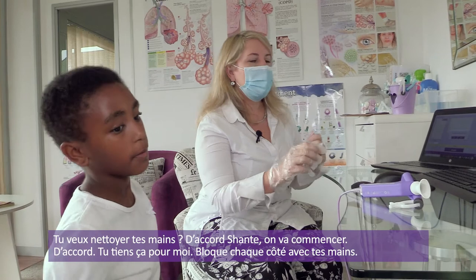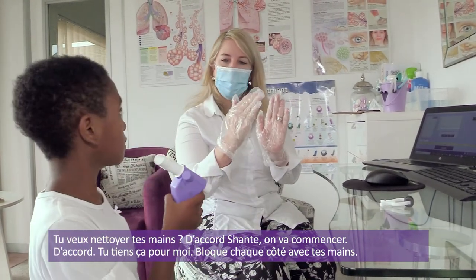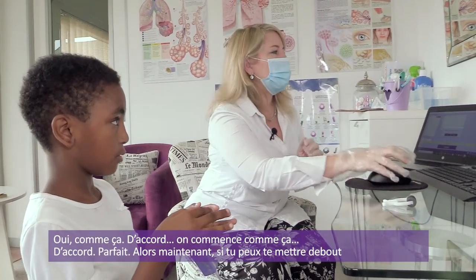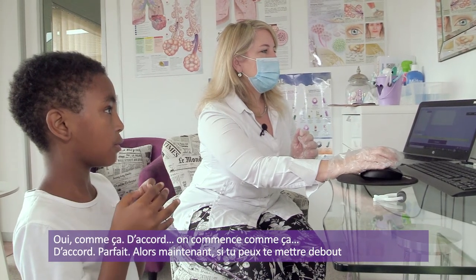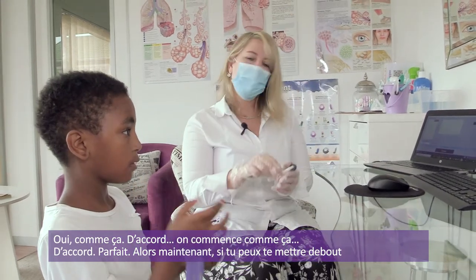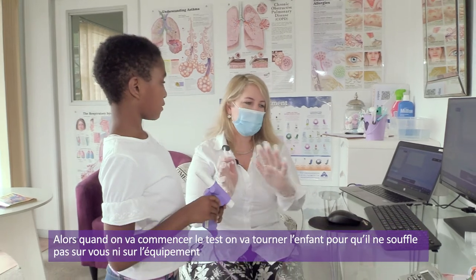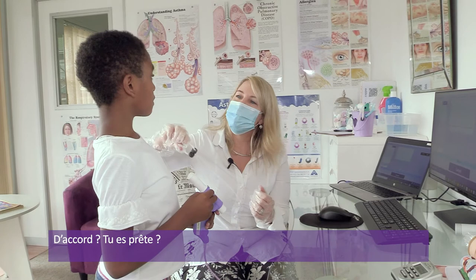All right, so what I'd like you to do is just to hold this for me. Can you just block each side of it with your hands? Good girl. Yes, that's perfect. Okay, we're going to get started like that. Perfect. Okay. So now if you could stand up. When you are doing the test, you're obviously positioning the patient so that they're not blowing onto you or onto your equipment. All right. You ready?